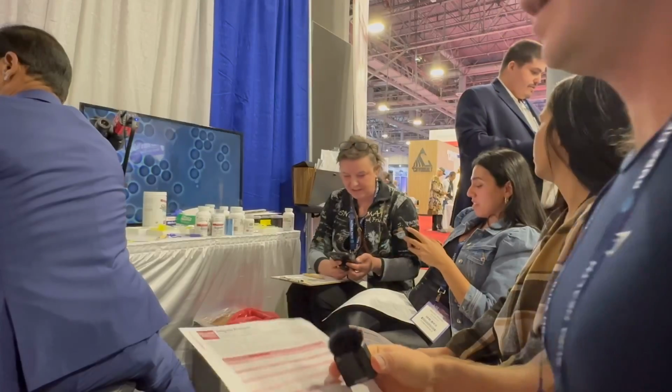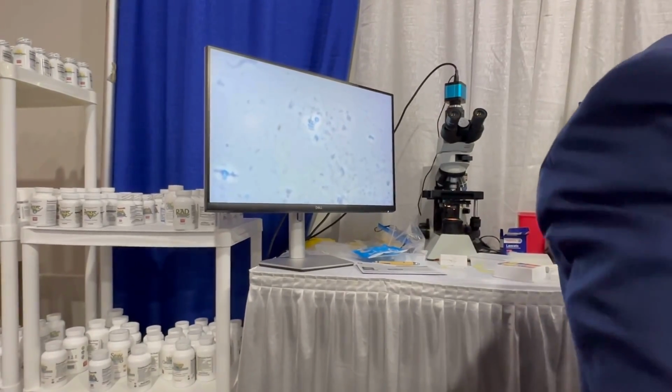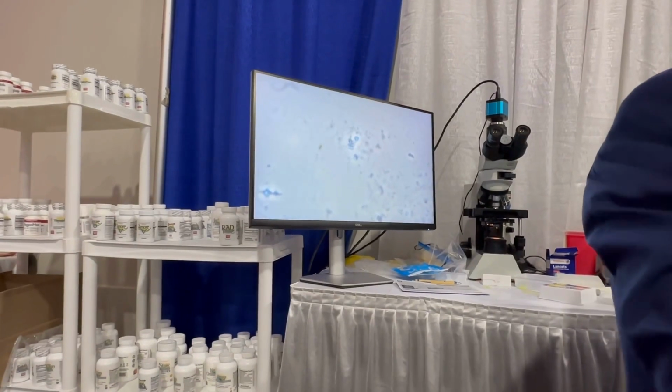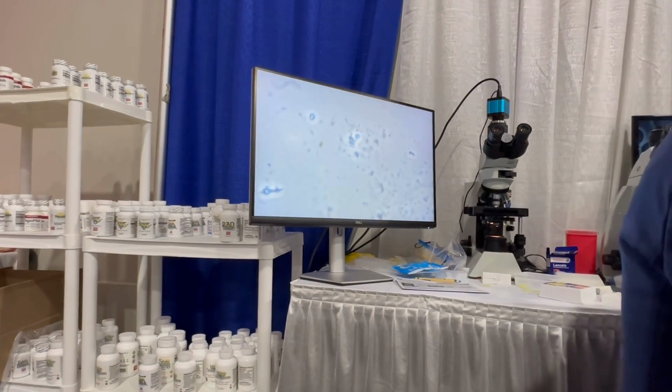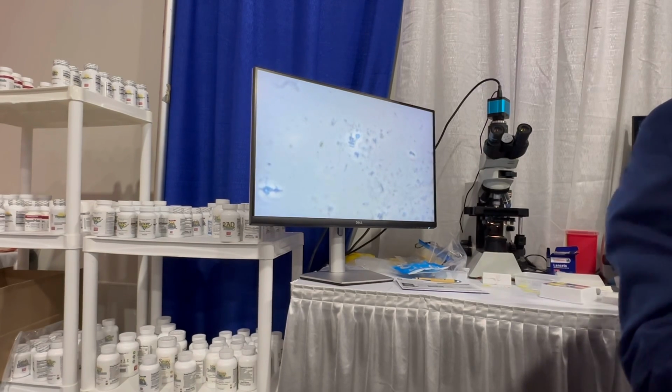It's common. Okay. Are you familiar with that? What is that? It's biological dentistry. So when time permits, I take certain samples from certain people, and then we look. Those are spirochetes. That's correct. And it's a subgroup of Lyme's. Is it from her blood or from her mouth?